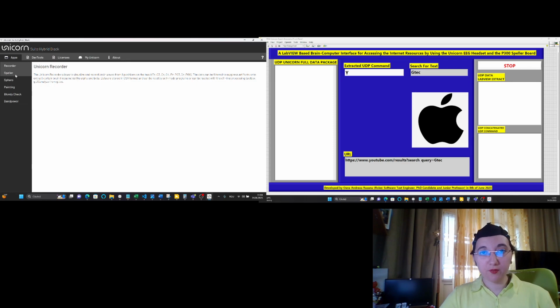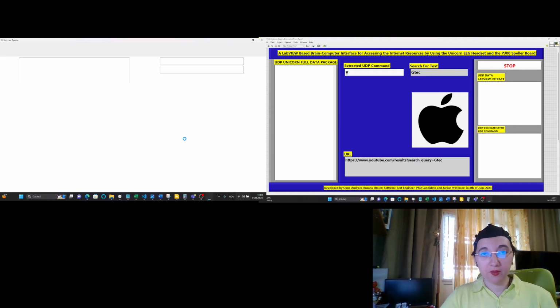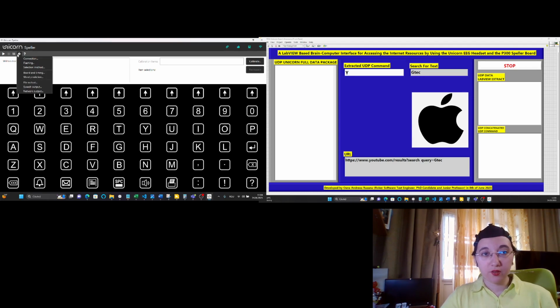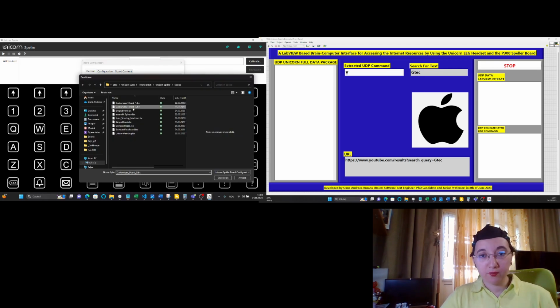The Unicorn Speller needs a paid license. It gives users the possibility of customizing our own original boards. I'll close this one. This is the Human Faces Speller board. As I said, I created my customized speller board, so I will upload it. This one.